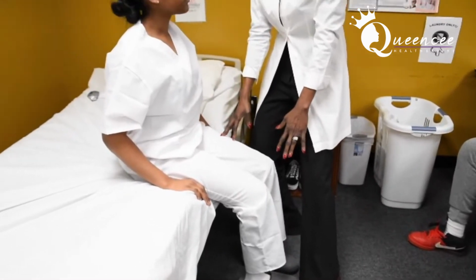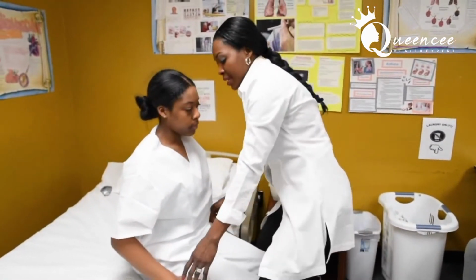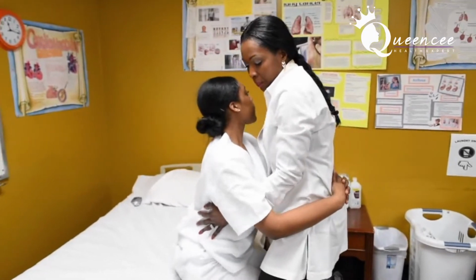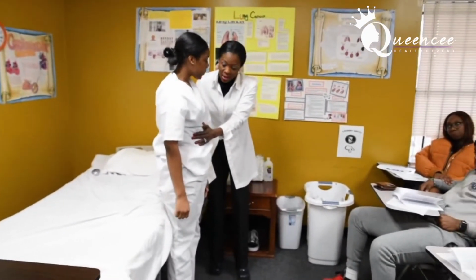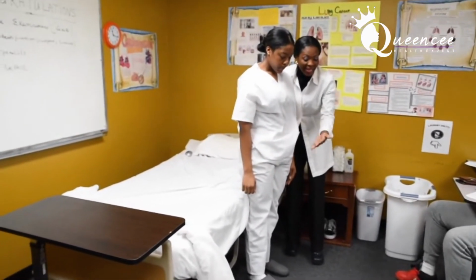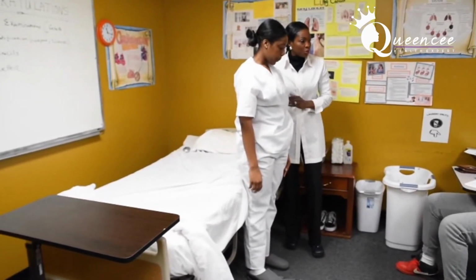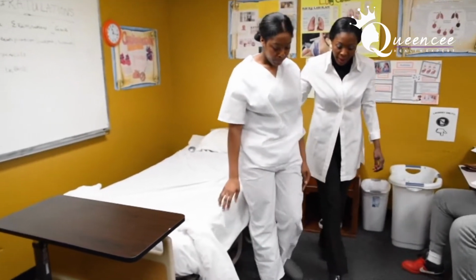When we stand up, you're going to get to the middle of the scale, all right? Wrap your hands around me, and on the count of 3, we will stand up, all right? 1, 2, 3. Okay. When your patient stands, you're going to support them behind the back and help them to the scale. Although this is your classmate, they're acting as a patient for you, so you have to support them. It's part of the skill. Let's walk to the scale.